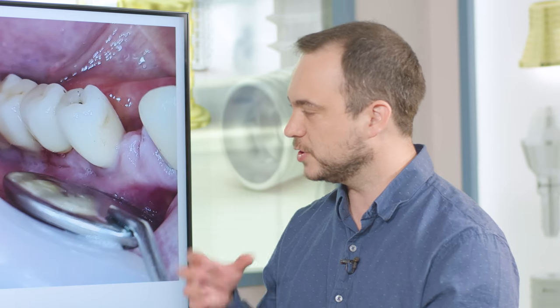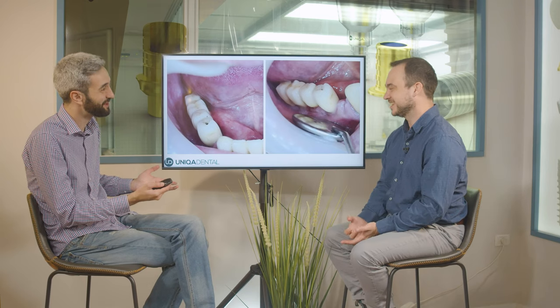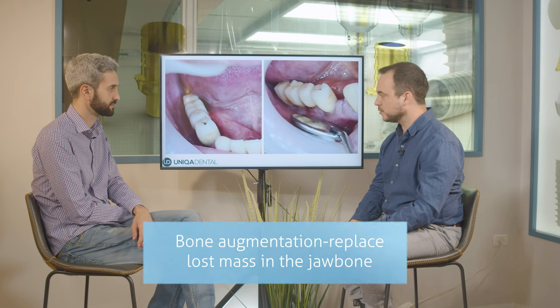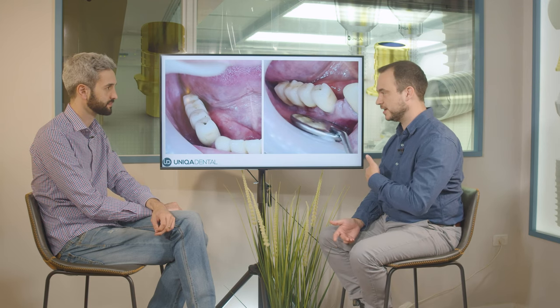Here we have a problem because you don't have enough space for anything. So the question is, what are you going to do? We have different options. The first option is bone augmentation — we can add an implant and have a single crown on a single implant. Or maybe a five-unit bridge on five implants, but that's maybe a little too many implants for a five-unit bridge.